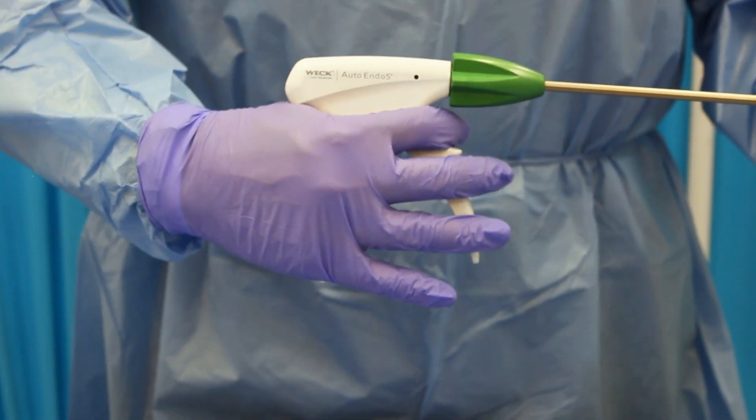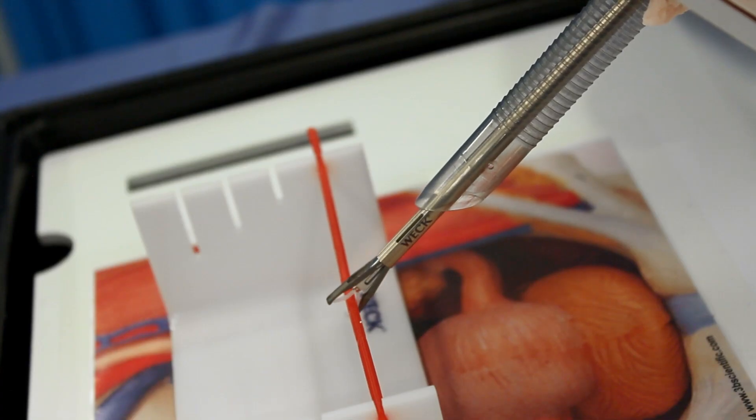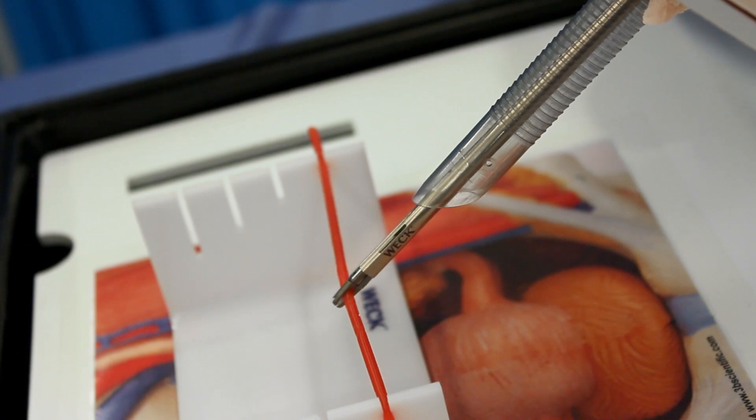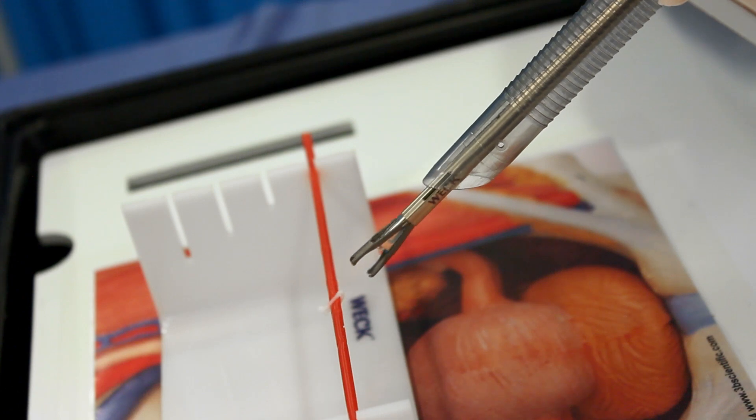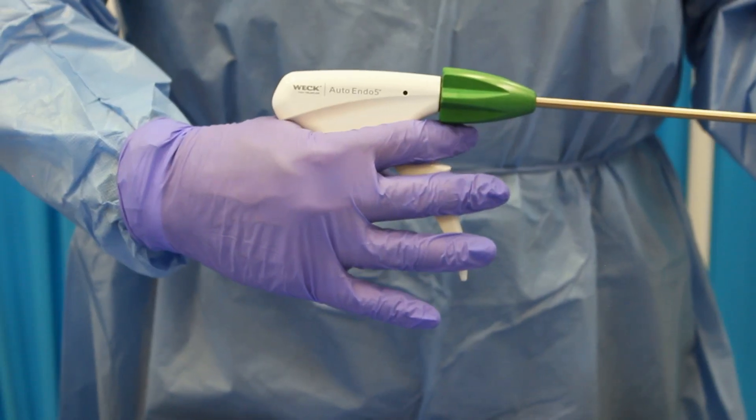Step 4: Fully compress the applier trigger so the jaws close and the clip locks. An audible click will confirm that clip closure is complete. Fully release pressure on the trigger. This allows the applier to return to a reset position. An audible click will confirm that the applier has returned to the reset position.